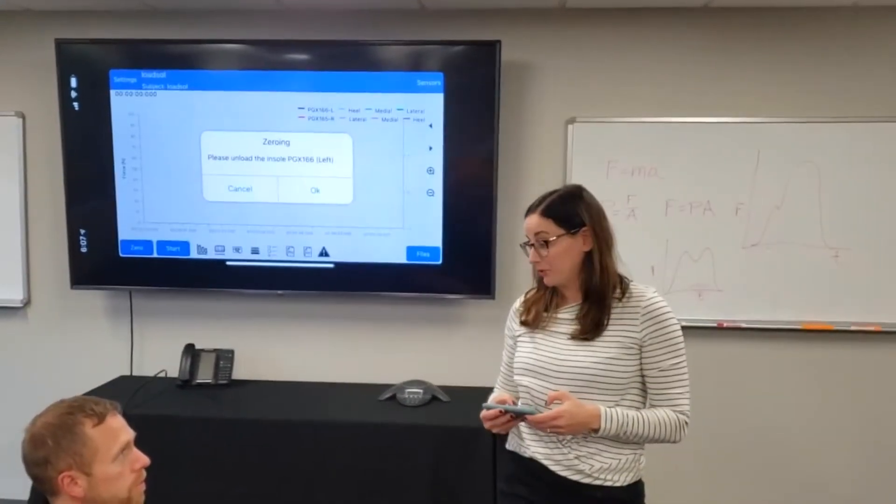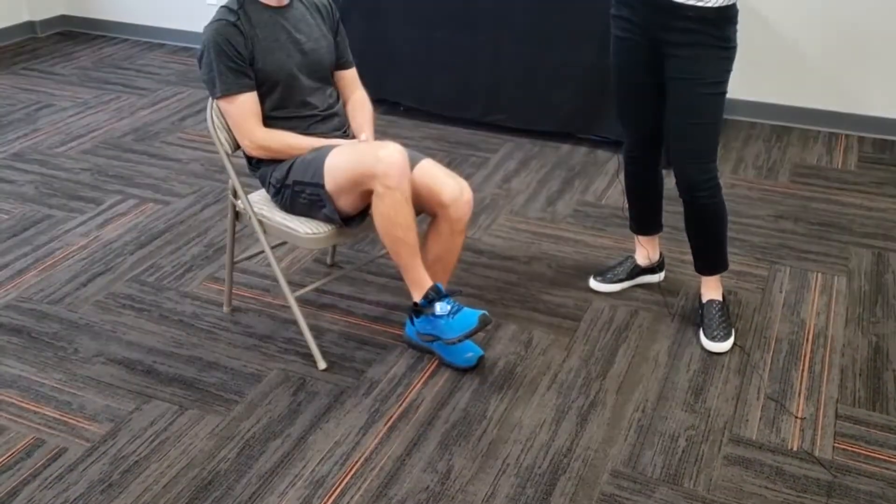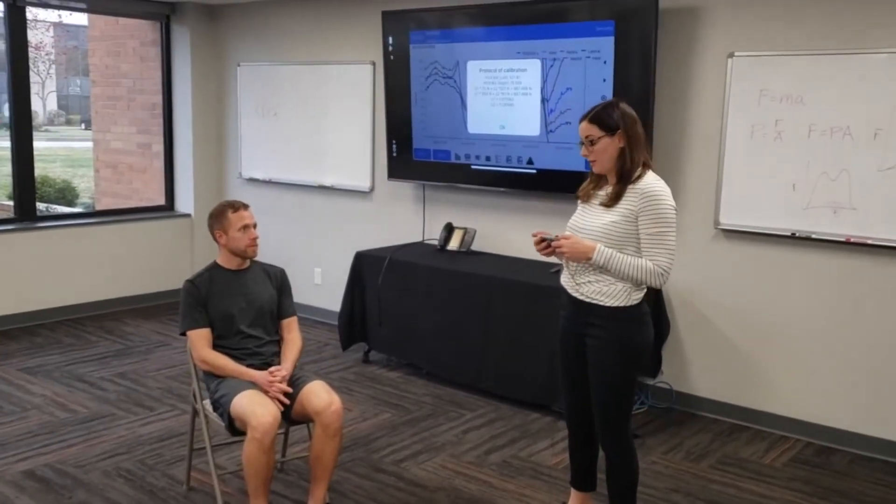If you could lift up your left foot, please, Ben. And now your right foot. We have completed the calibration process and are now ready to begin a measurement.